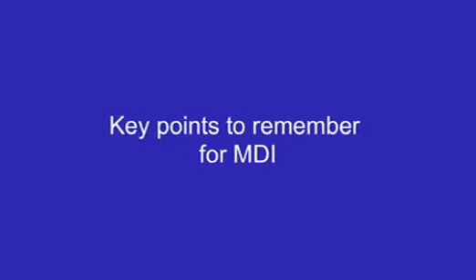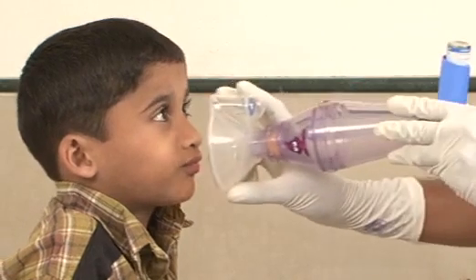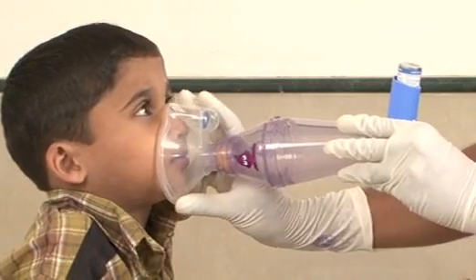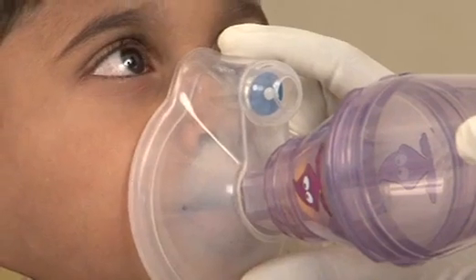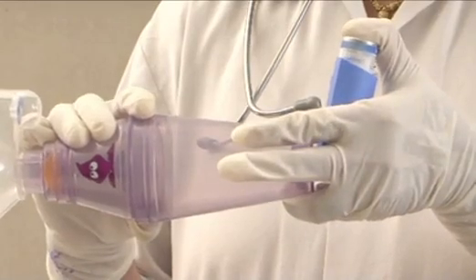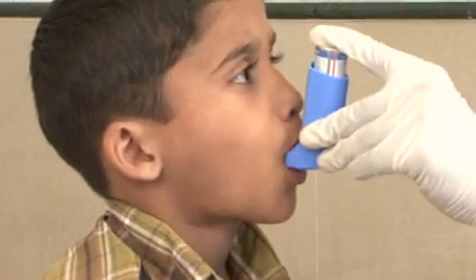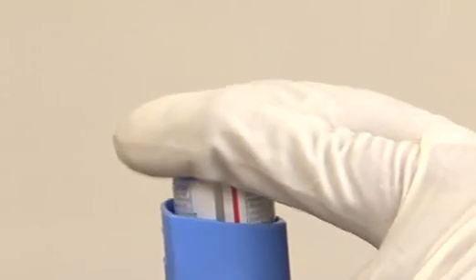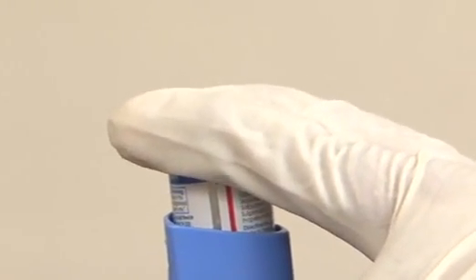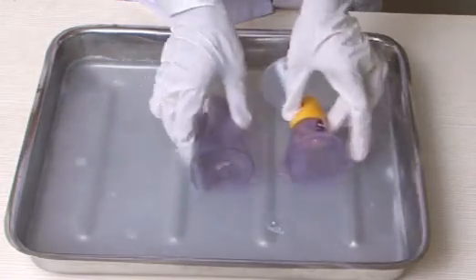Key points to remember for MDI. Use spacer in infants and children since it improves the drug delivery and effectiveness. Ensure prescribed and correct dosage. Regular cleaning helps in maintaining effective drug delivery.